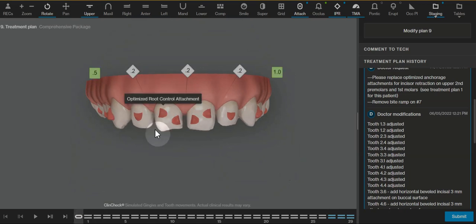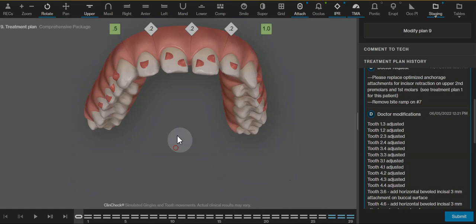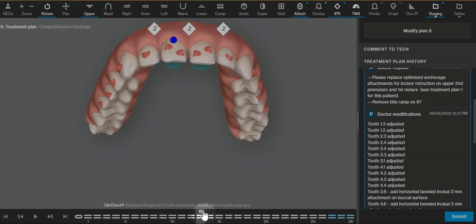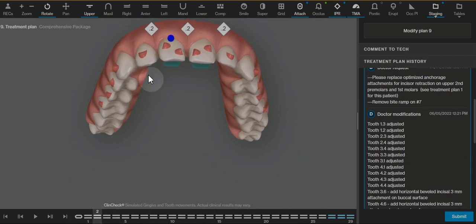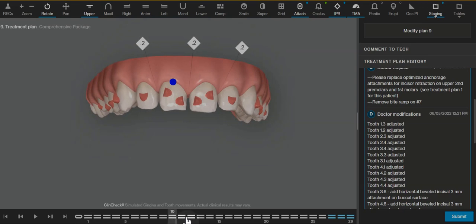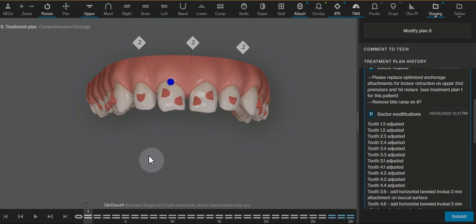So you can see that the root is pointed to the distal, and if we were to just—I know we're doing lingual retraction but these teeth are coming to the mesial slightly. Without an attachment, this tooth is likely to take the path of least resistance and the crown to just tip to the mesial, accentuating what's already happening.